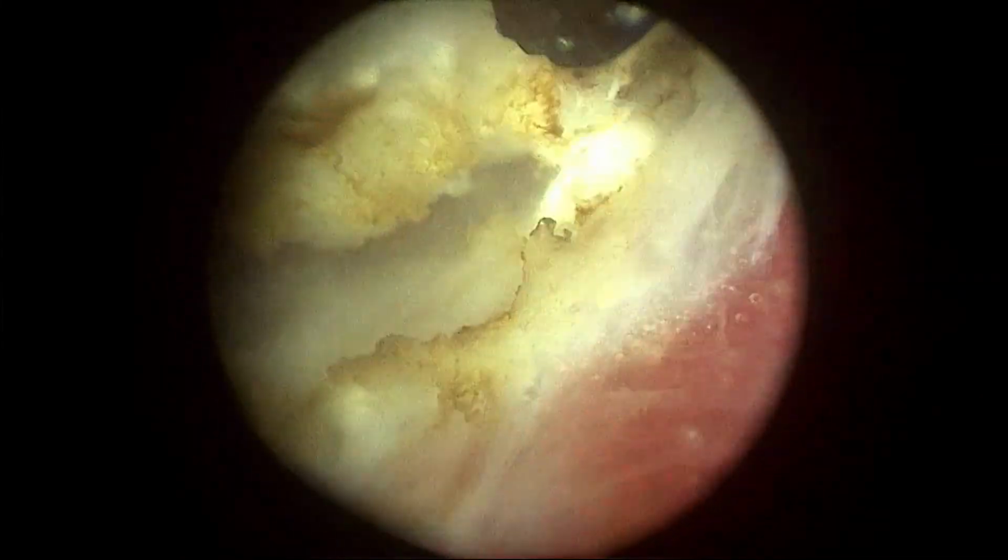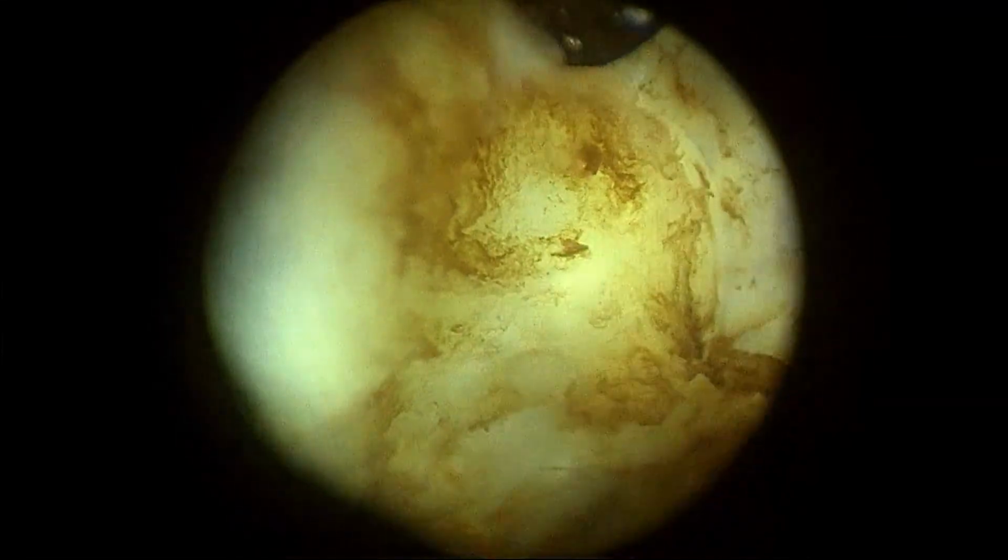They're still not able to fix that bleeding, and most likely will not be. Seems to be a very vascular prostate. For a conference, a 120 gram prostate is a big task.